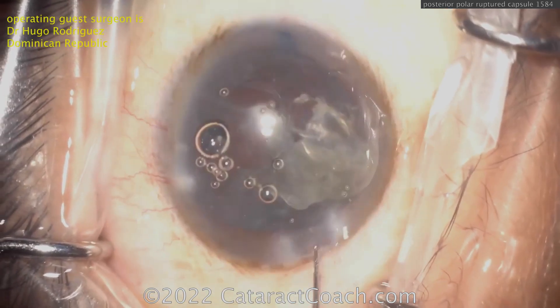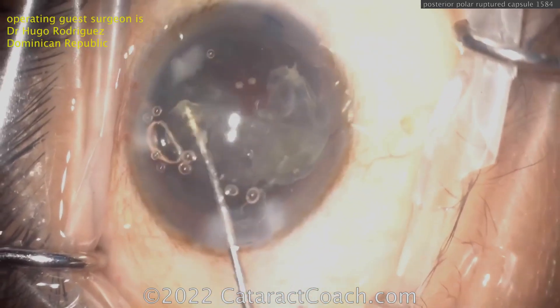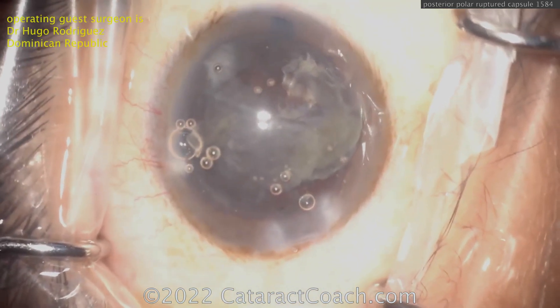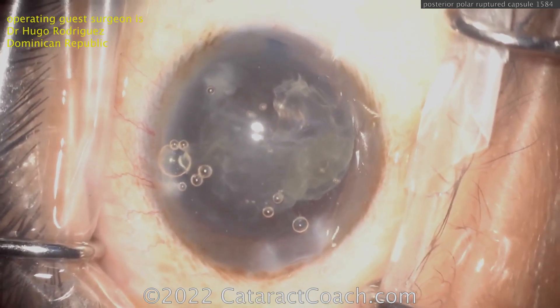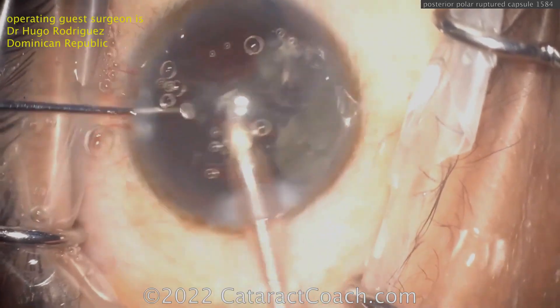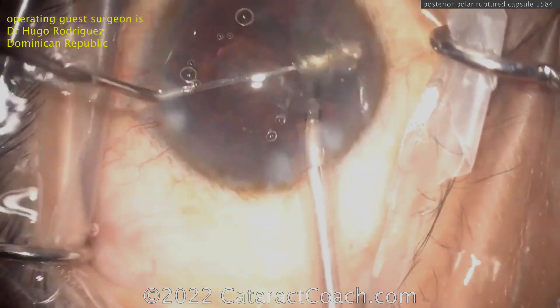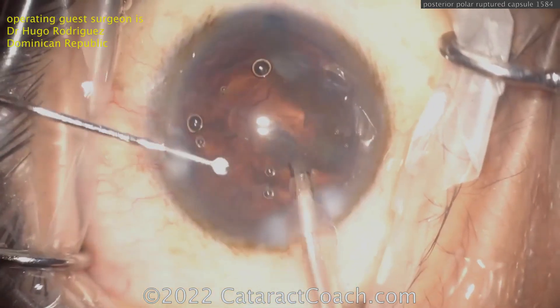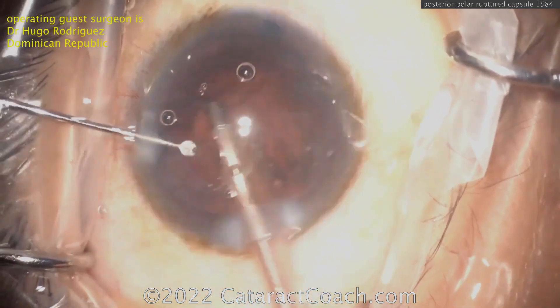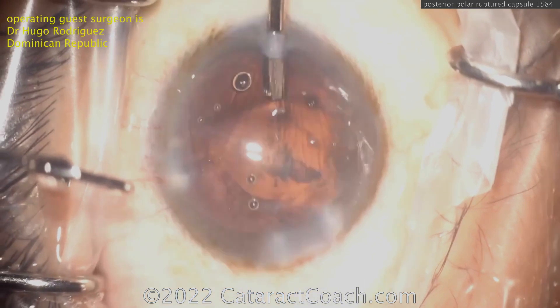Now it's time to remove this and do a little anterior vitrectomy. I have a case of my own — if you go to CataractCoach.com and search for Posterior Polar, in the last many years I had one patient where I had to do an anterior vitrectomy. And guess what? He had a beautiful outcome — 20/20 vision, absolutely thrilled. So don't worry if it happens to the best of us. You've got to know how to handle it.